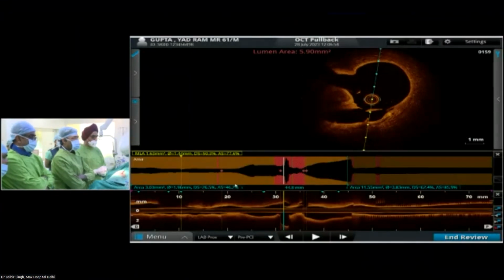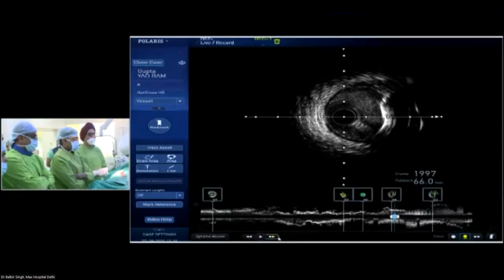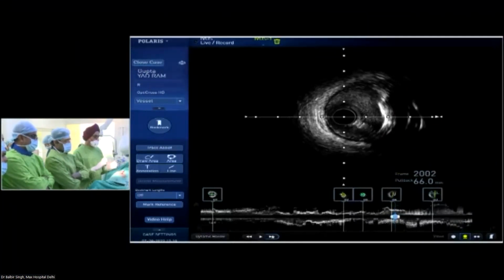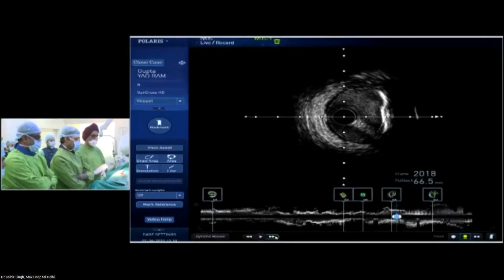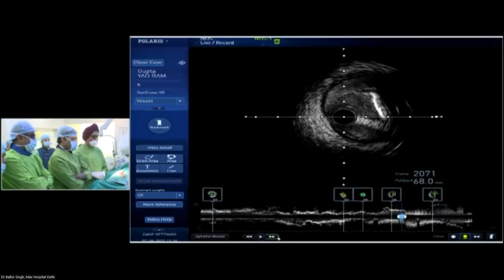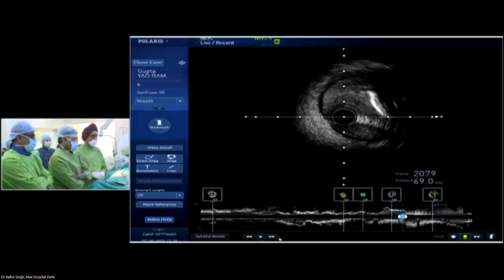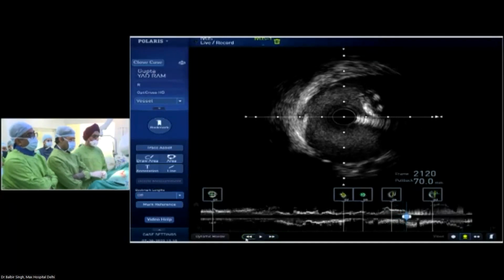It's okay, no problem. We'll show you the OCT. So this is the calcium and probably a calcified nodule, but we're not sure. There's calcium on one arc, even proximally. It's not 360 degrees, which is what you were very certain of. If you go a bit back, there was some more calcified segment. Go back, go proximally. Yeah, this is the calcium I have. No, not 360 degrees, in the ostial LAD, I think.